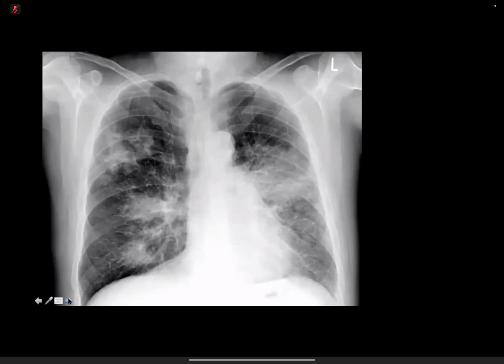This is a frontal chest radiograph of an adult patient. There are multiple bilateral airspace opacities, which especially in the right chest appear to represent nodules or masses with spiculated borders. And on the left, there's a more ill-defined mid-zone opacity. I don't see any obvious mediastinal enlargement to suggest lymph nodes, but nevertheless, my next step would be to perform cross-sectional imaging to assess this for either primary or secondary malignancy. Good.